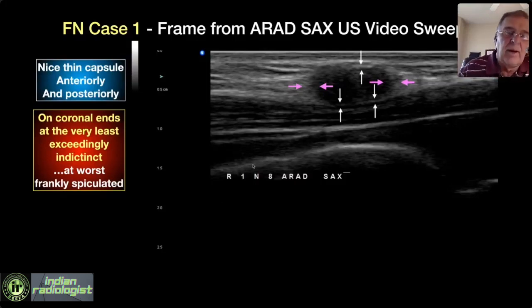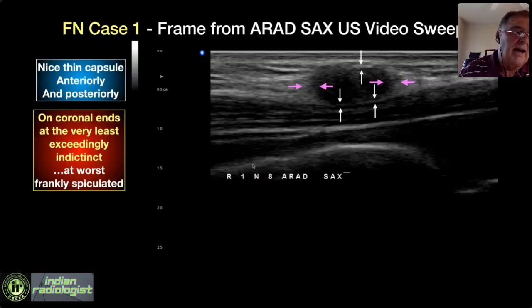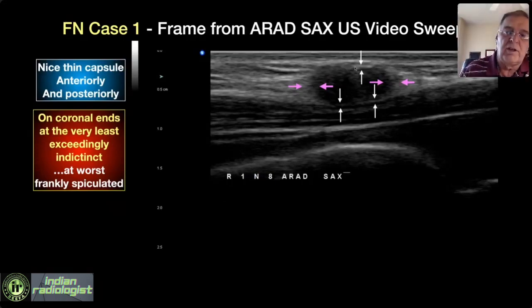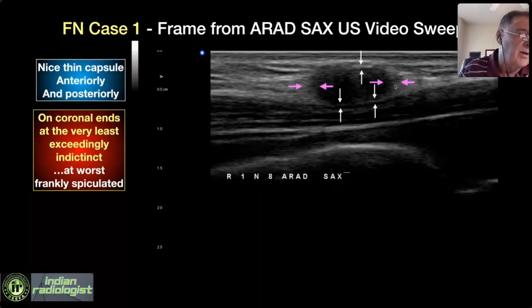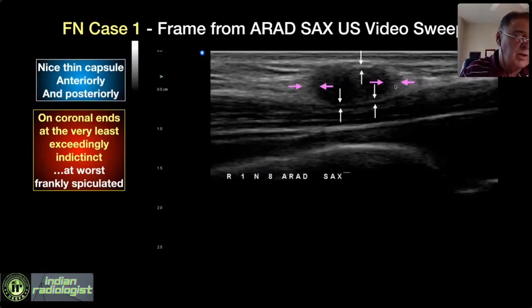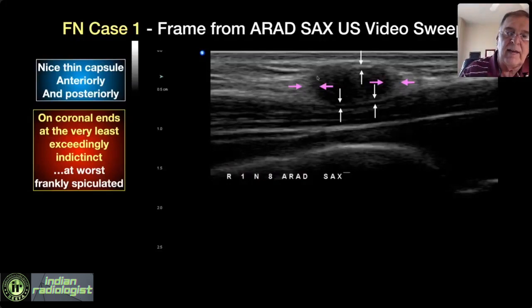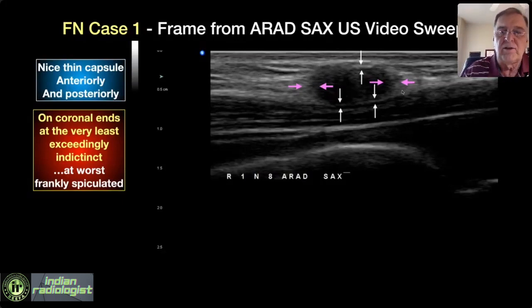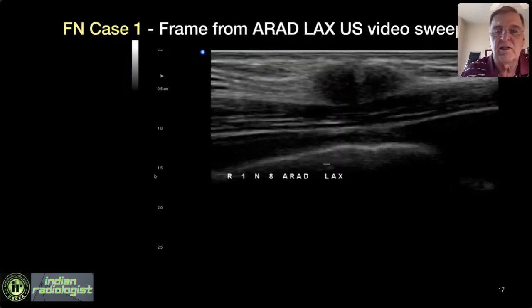Axial resolution of ultrasound is about 100 microns; lateral resolution is 500 to 1,000 microns. We have much better resolution of the capsule on the front and back because that requires axial resolution at high frequency. Showing a capsule on the sides requires lateral resolution, which is lower. There is also critical angle phenomena — as the beam comes down, it reflects and refracts off these sides. So we actually have to manipulate the probe, use spatial compounding, and use whatever tricks we have available to show the capsule on the ends as well as possible.